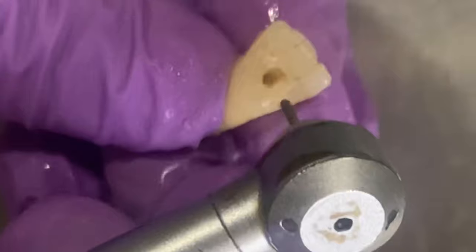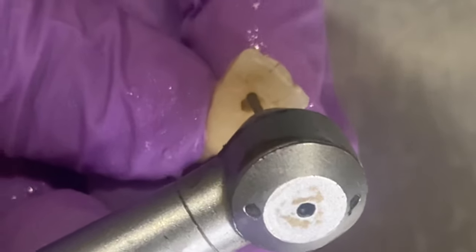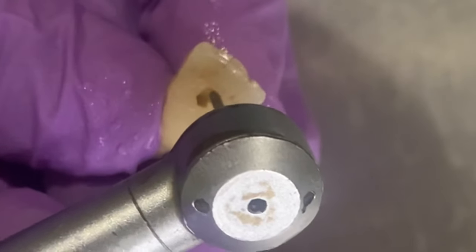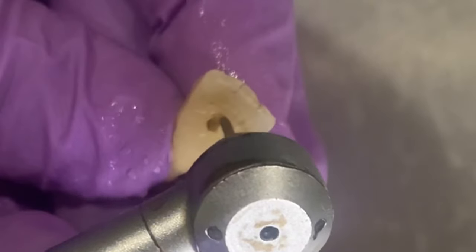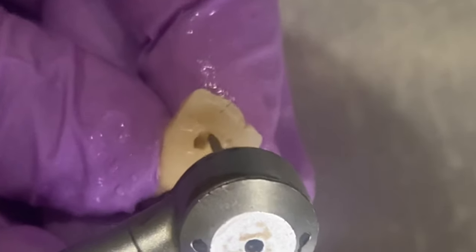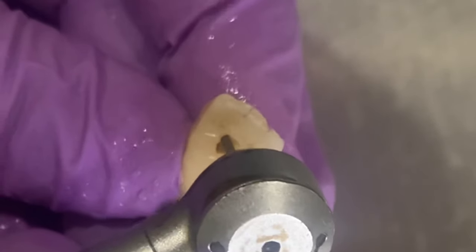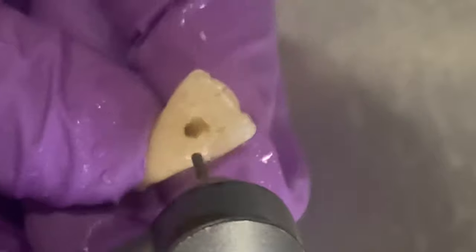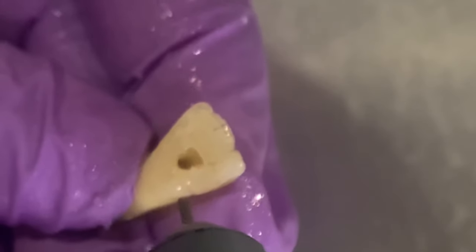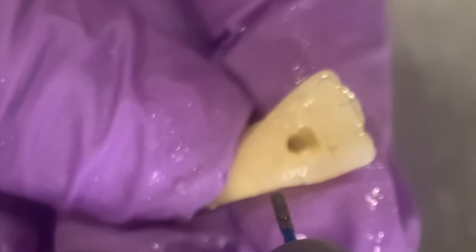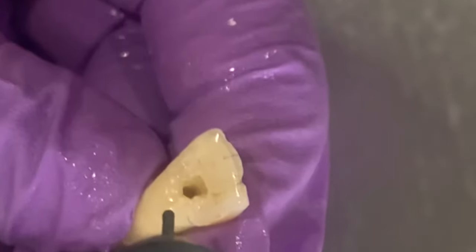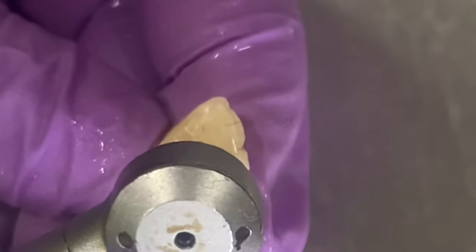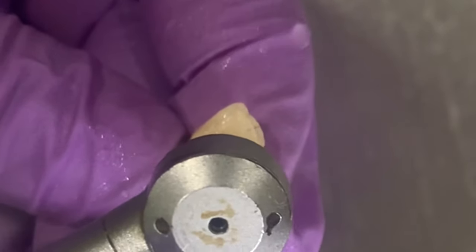Now at this stage it is important for you to know that the shape of a pulp chamber usually follows the contours of the crown, and in this case our pulp has three pulp horns which correspond to the developmental mamelons of the young tooth. Now as we proceed with our cutting, you can see we have roughly assumed a triangular shape.